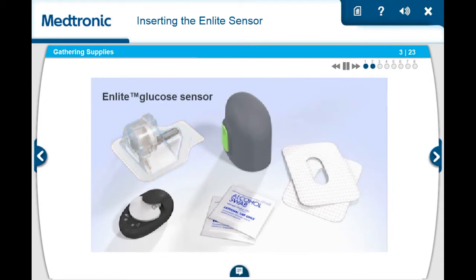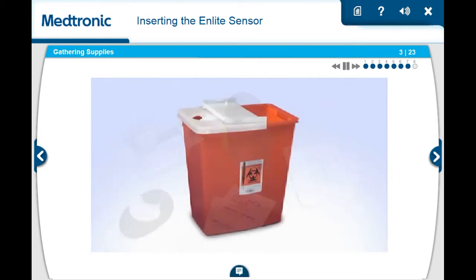An nLite glucose sensor. The one-press serter. Sensor overtape. A Guardian 2 Link transmitter that has been fully charged. An alcohol wipe. A sharps container.